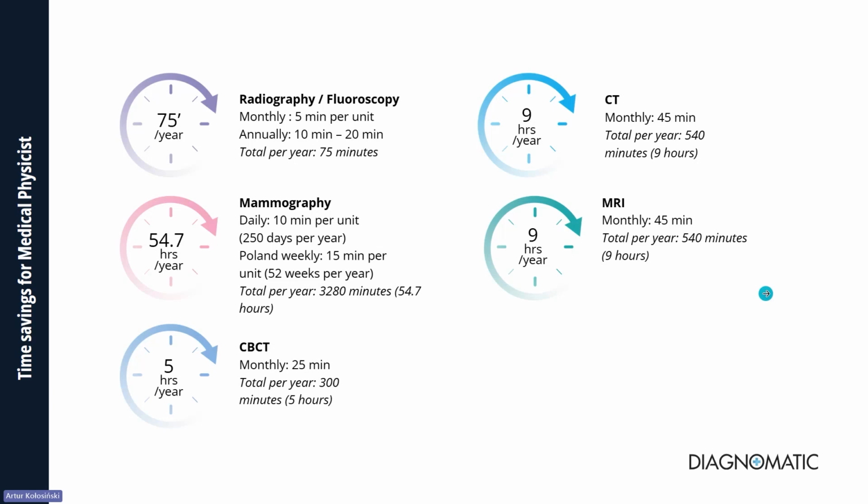Especially when we talk about the more complicated analyses like CBCT, MRI or CT, it can save us much time. But also mammography, where we have to do the daily checks.